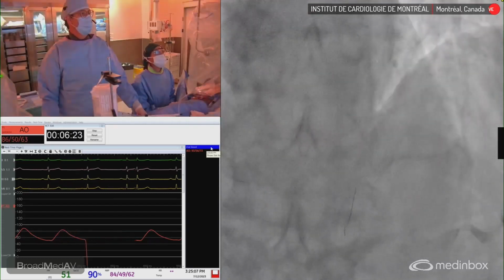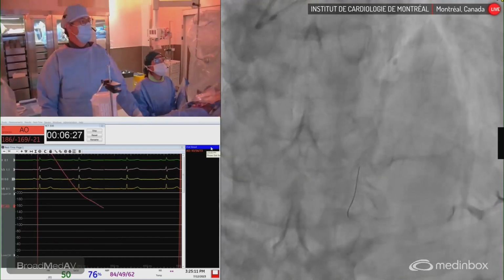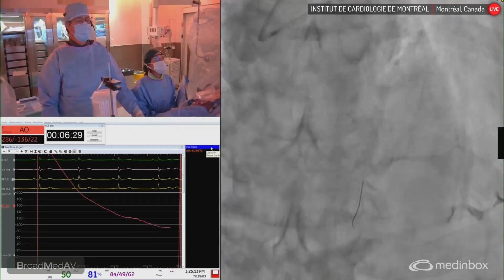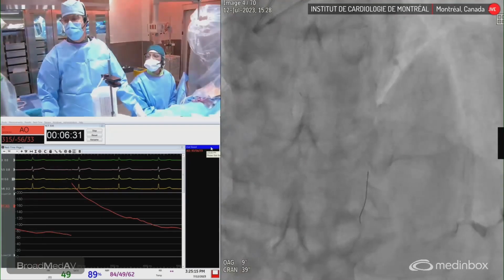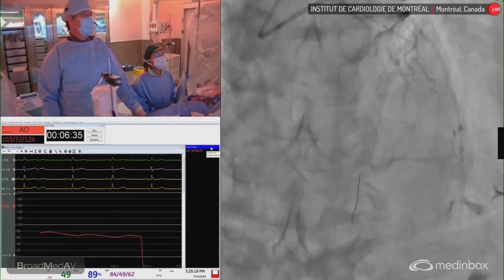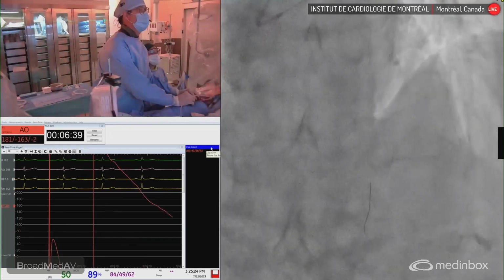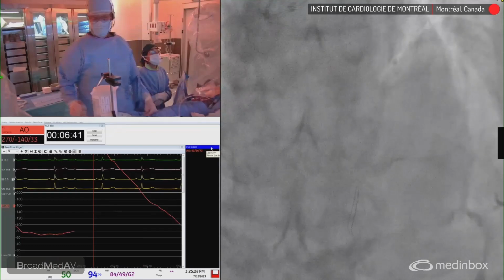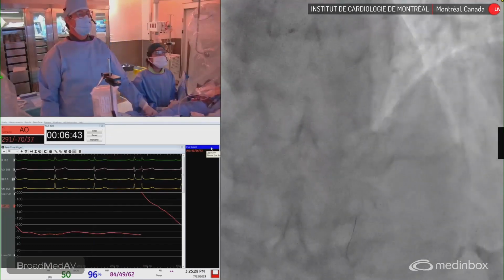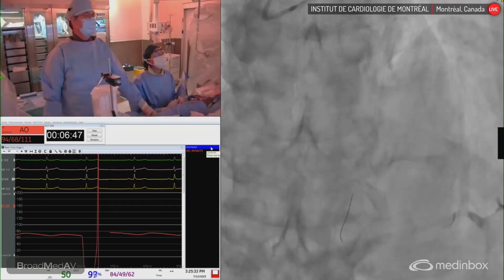C'est ciné ou c'est Scopy? Scopy. On va faire ciné, s'il te plaît. Okay. I'm ready. Vas-y. Ciné. It's a slow flow. Scopy ici. OK. Vas-y. Ciné encore? Attends, ouais. OK. La pression. Correct. Est-ce que c'est le burr?